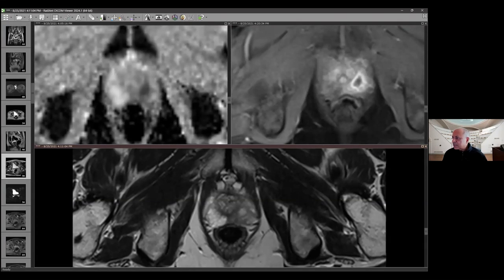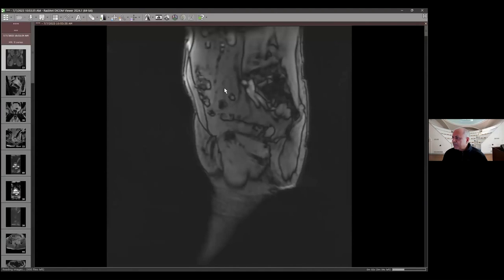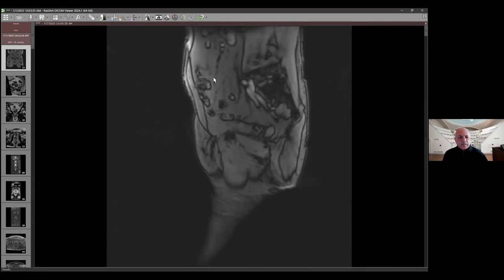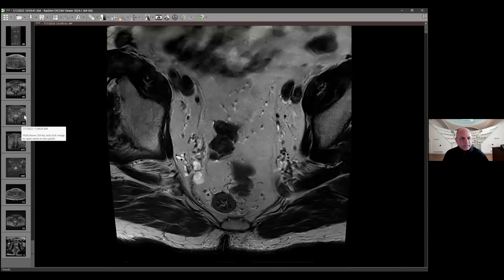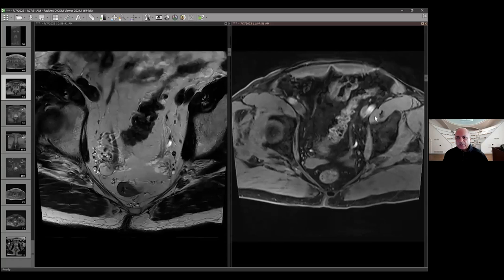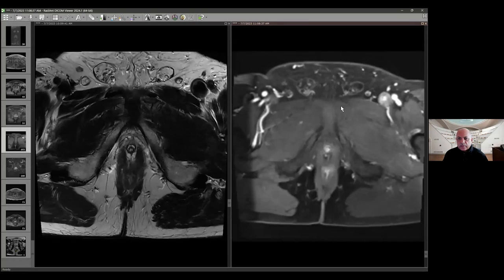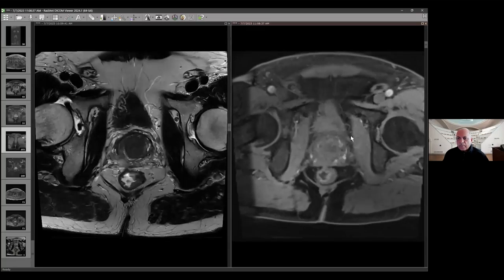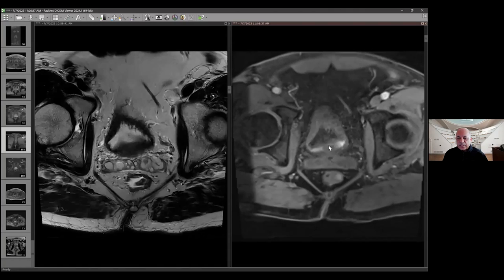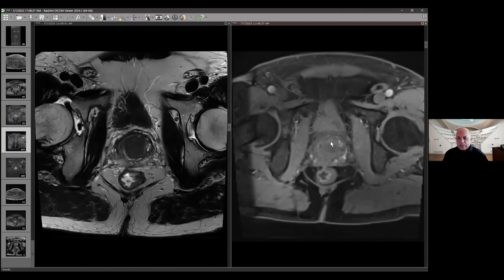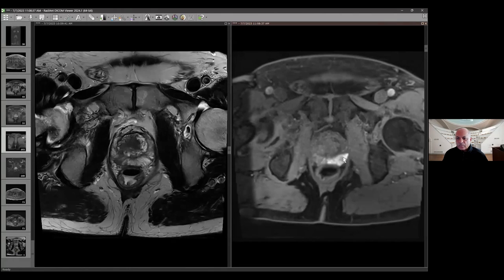Moving on to the next case — a 70-year-old who comes in with a slightly elevated PSA. His PSA density is not very high, it's 0.08. Something was felt digitally, so the patient was referred. Starting with the axial and looking at the T1 pre-contrast — you can see there is bright signal in the peripheral zone bilaterally. This is spontaneous bleed: the patient is 71, has some cardiac issues, and is on anticoagulation.